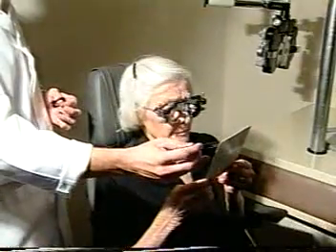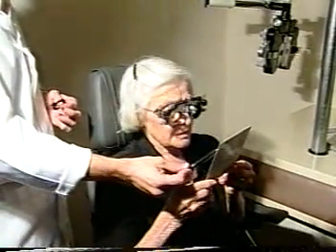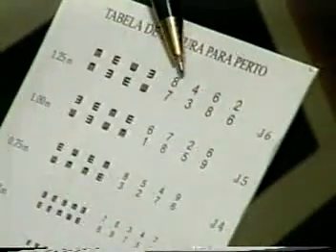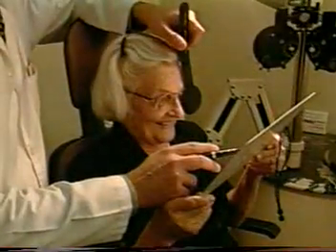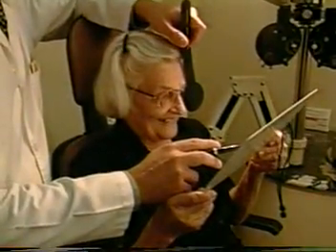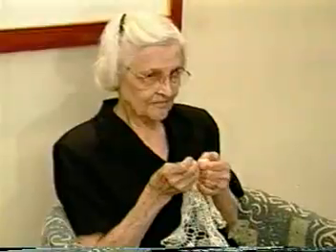Fluorescein angiography has been done to document the condition of the retina and retinal vessels. The postoperative examination is further extended, motivating and training the patient in the proper use of the intraocular device as a practical uniocular aid. While the non-implanted eye is used for general orientation, the implanted eye is used to obtain the desired magnification of the target.